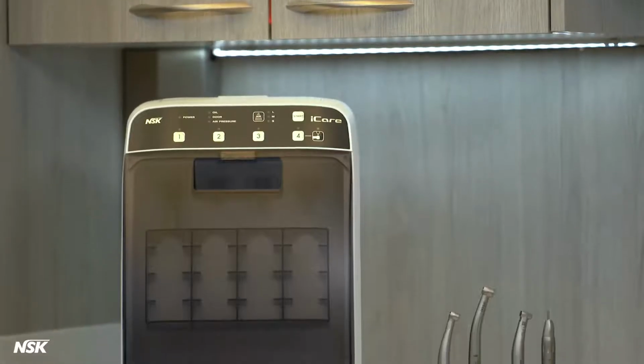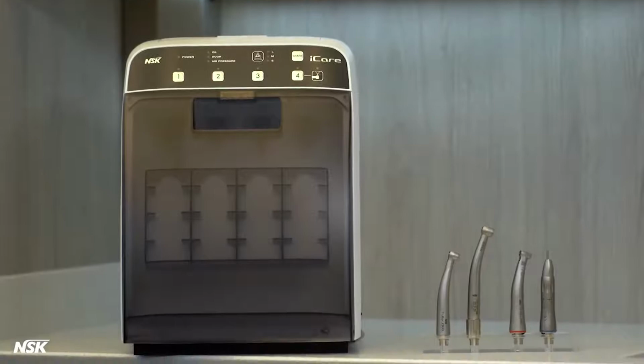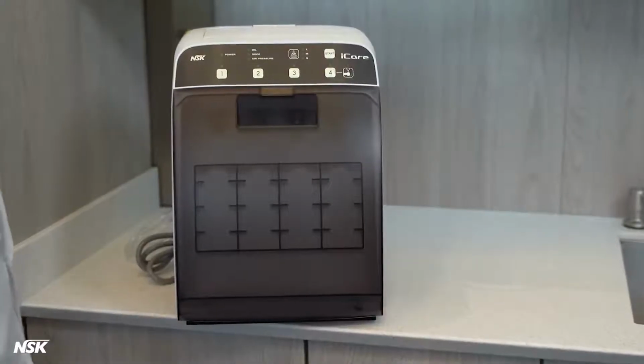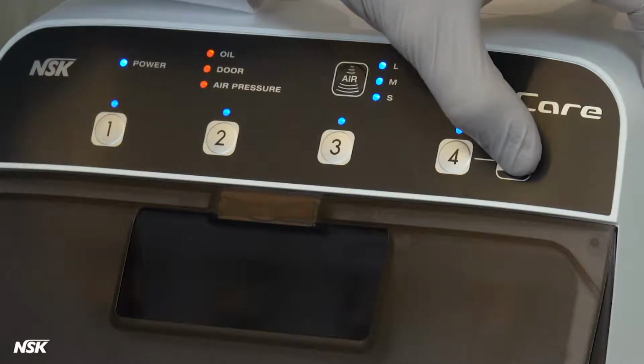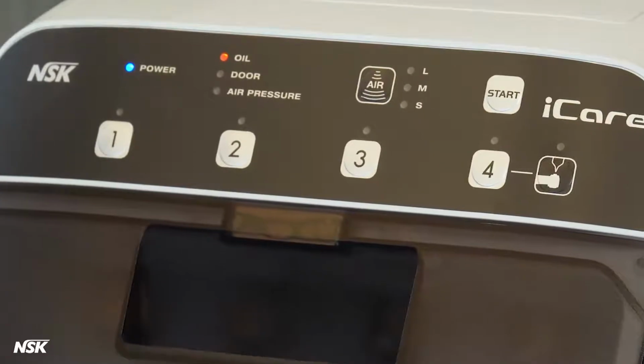Priming. Before operating, it's important to prime your iCare in order to circulate oil in the machine. You will only need to prime your iCare 1 time when it is first installed. Make sure the door is closed. Then turn the power switch on while pressing the chuck cleaning button. You will hear a beeping sound and see the oil air light turn on. This is normal.